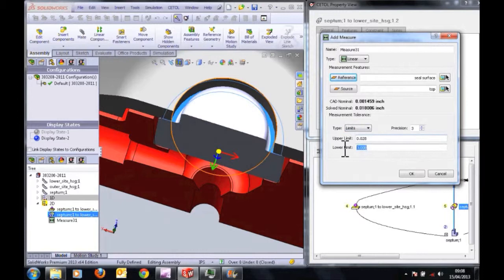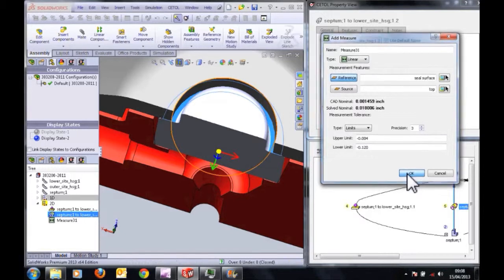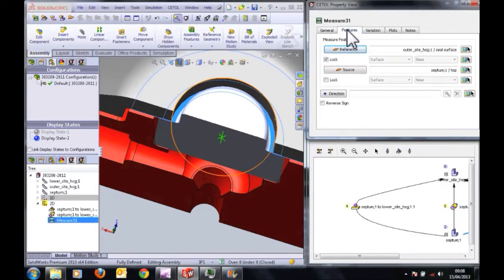Now I just need to tell it which limits it can lie between. I'll use negative numbers to represent an overlap. I don't care how big a negative overlap I get, but what I do want is to make sure that we never go below an overlap of 0.004. That will just represent safely my seal condition. Now it just happens the way I've set this up that I'm going to get a positive value for overlap rather than a negative value.